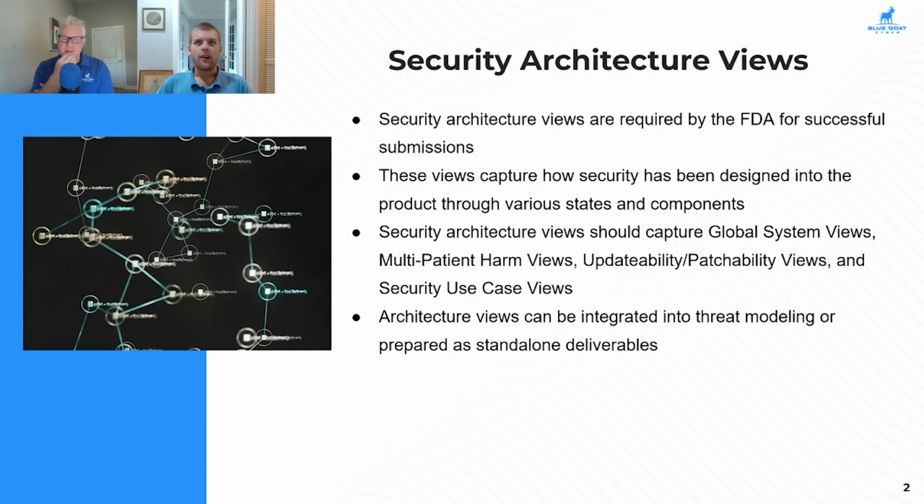Yes, yeah, very similar documentation requirements across a lot of these global regulators, and conveying how security is built into your system is going to be applicable across many different submissions. So this would work great if you're going not only for that FDA submission in the US, but the MDR in Europe, if you're looking for the PMDA in Japan, the MFDS in Korea, if you're looking for submissions in the Middle East, Australia, Singapore, Thailand, all of these have similar requirements.